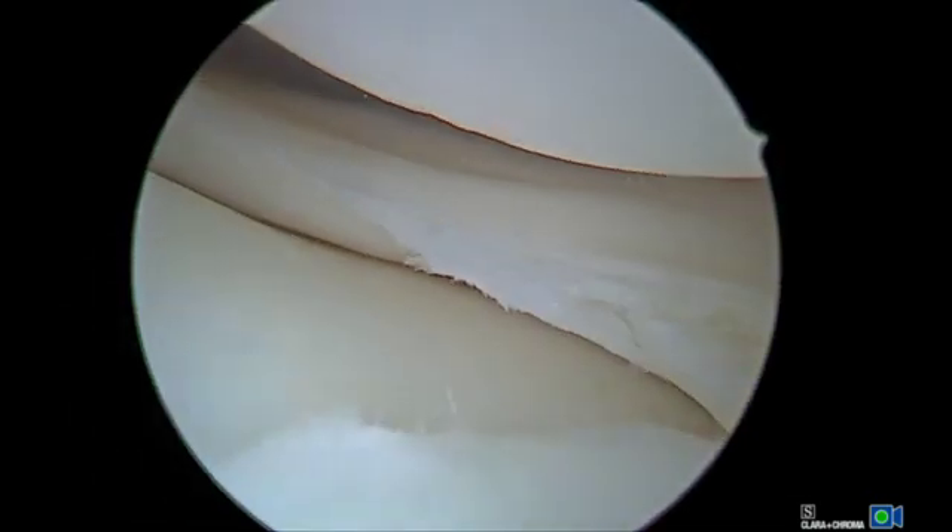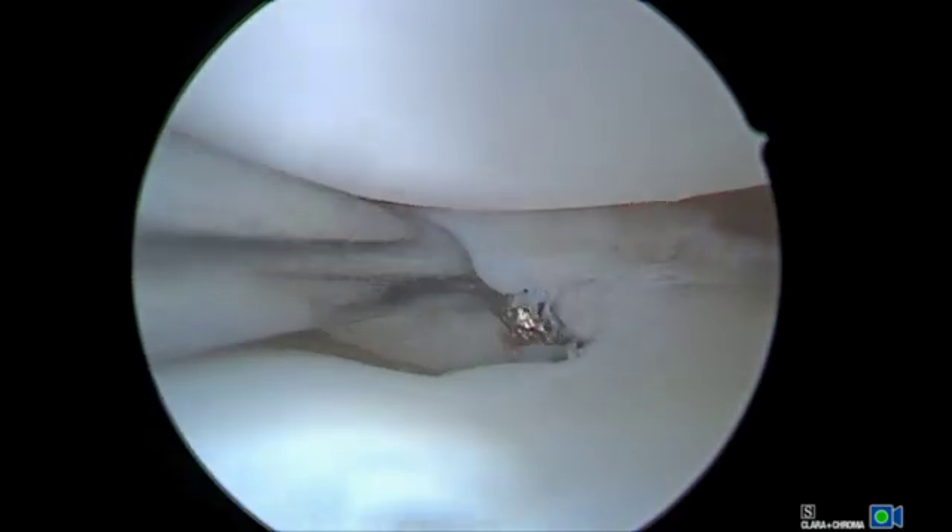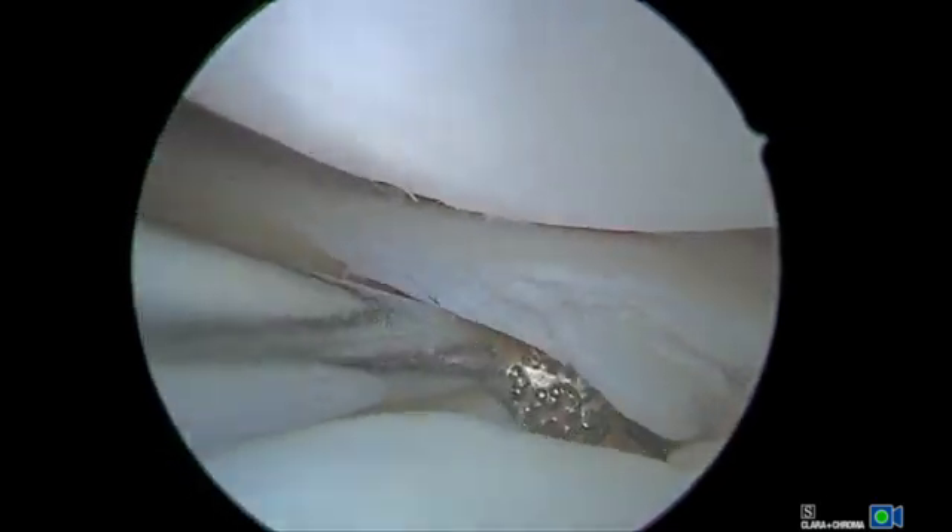Once reduction can be confirmed, allowing for successful repair, the meniscus should be prepared for best biologic healing response. In this case, the area is rasped.